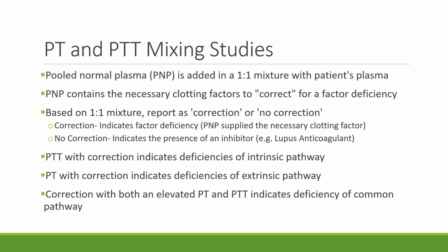All right. So if we have a prolonged PT and PTT, or PTT, we can perform a mixing study for one or both. Most of the time, we're going to see a PTT prolongation, and that's because there are more factors associated with the intrinsic pathway than there are in the extrinsic pathway. We also know that the factor deficiencies in the intrinsic pathway occur more often than the deficiencies that we find in the extrinsic pathway. So although we do PT mixing studies from time to time, more frequently than not, we do PTT mixing studies.